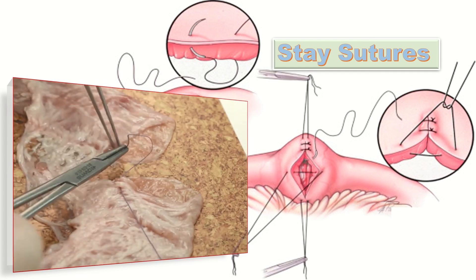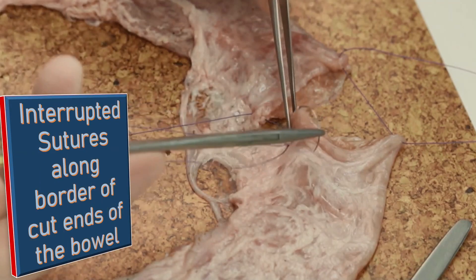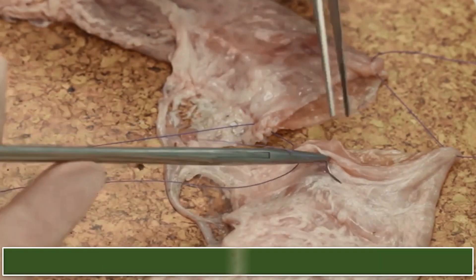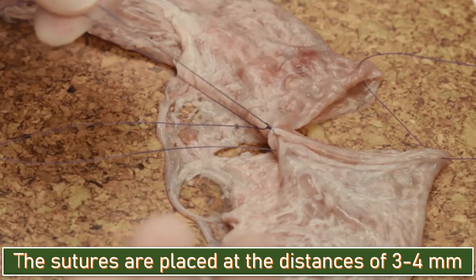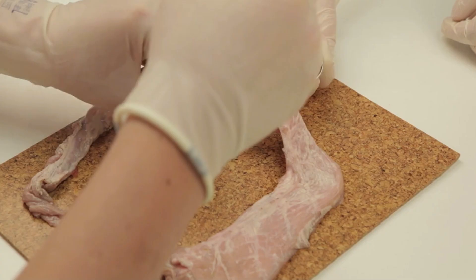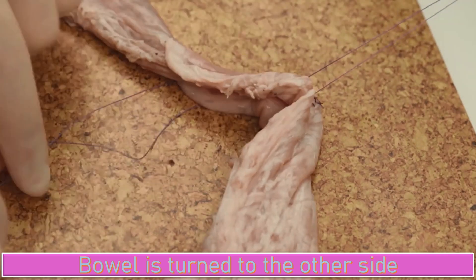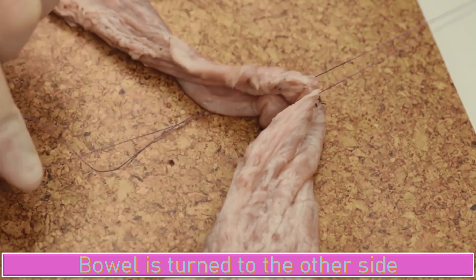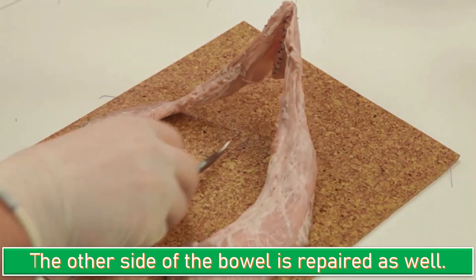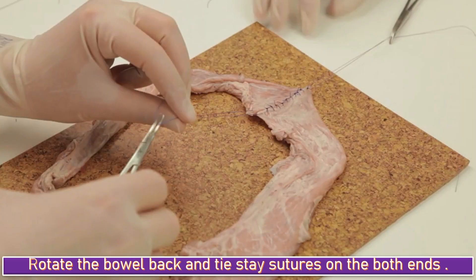After that, interrupted sutures are taken along the border of the cut ends of the bowel. The sutures are placed at distances of 3–4 mm. Once one side of the bowel is repaired, the bowel is then turned to the other side, and the other side of the bowel is repaired as well. Then rotate the bowel back and tie stay sutures on both ends.